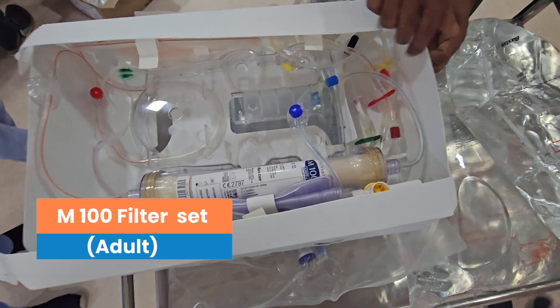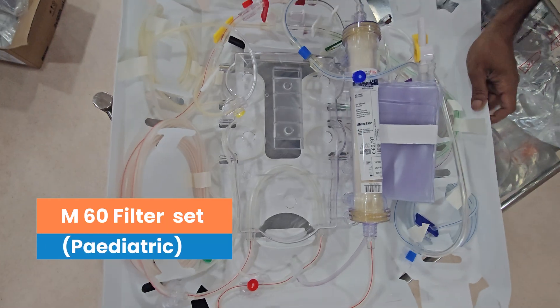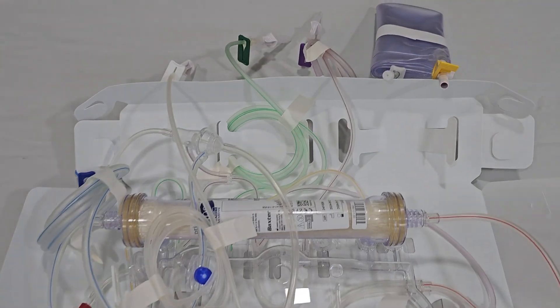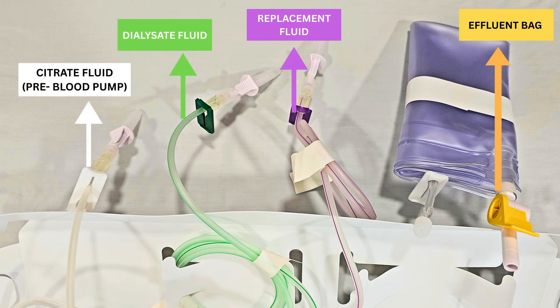The filter set package is opened. M100 is for adult use, M60 is for pediatric use. There are color-coded connectors which need to be identified.